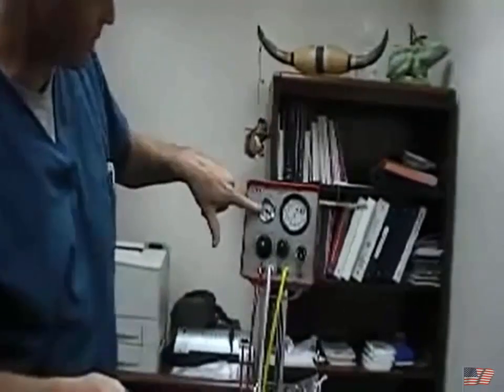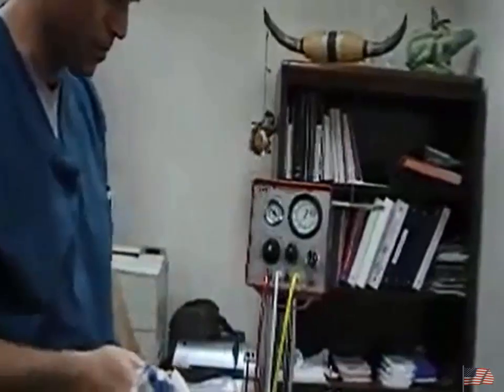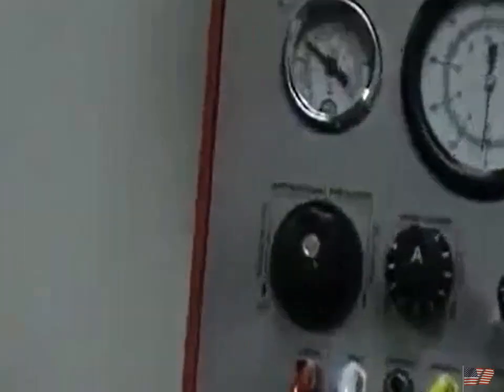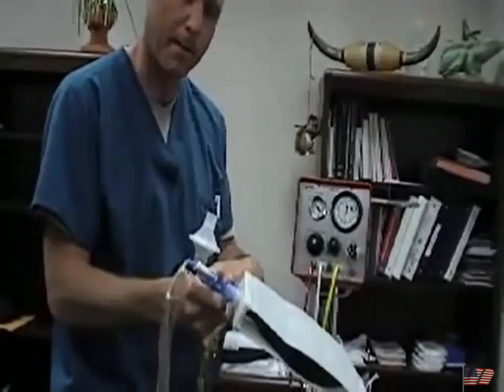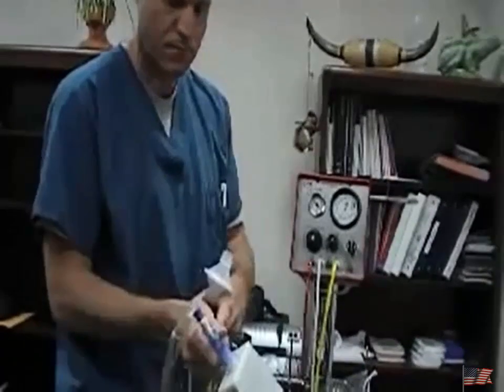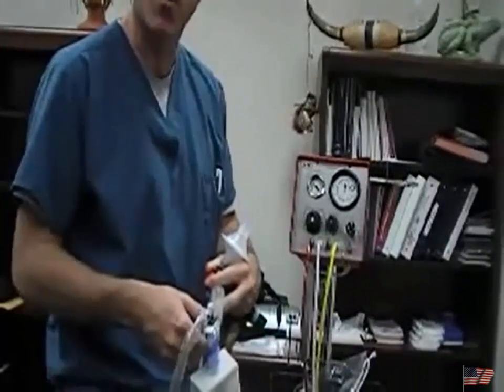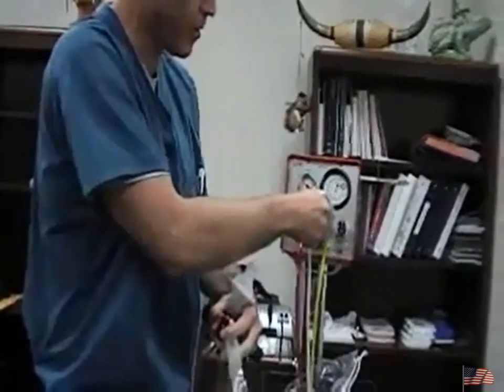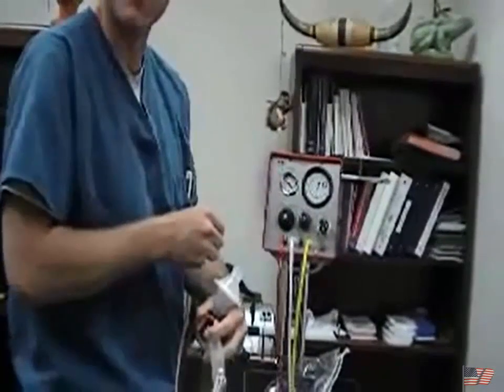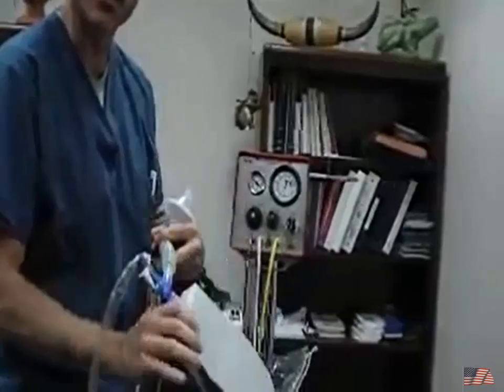Okay, see where my drive pressure is, about 35, so kind of middle of the road there. All right, started at the noon position. Okay, and you can see what it would be doing to the lung. You want to observe the chest for good movement. If you don't have good movement, make sure the machine's set up properly, or you may need to go up on the pressure a little bit. Now, as the treatment goes, I'm just going to move the frequency around a little bit. And notice it changes the pitch and moves the mean airway pressure around.